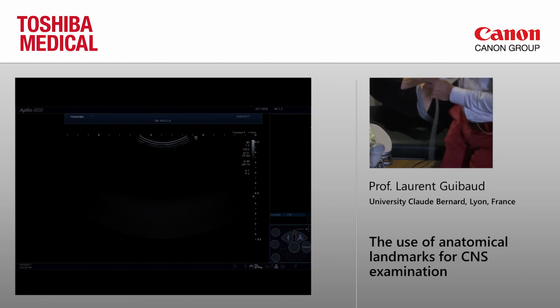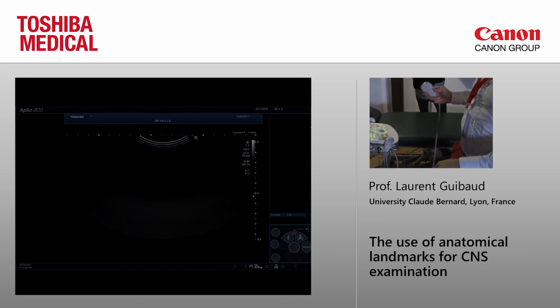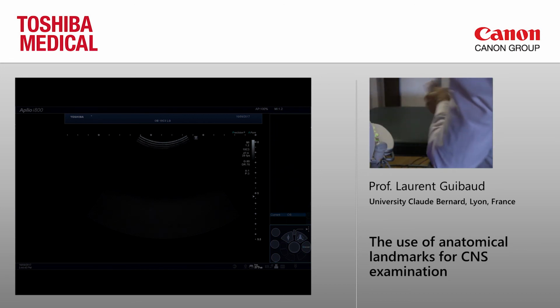So same question. You don't know the gestational age, and we'll try to have a quick look at the Sylvian fissure.